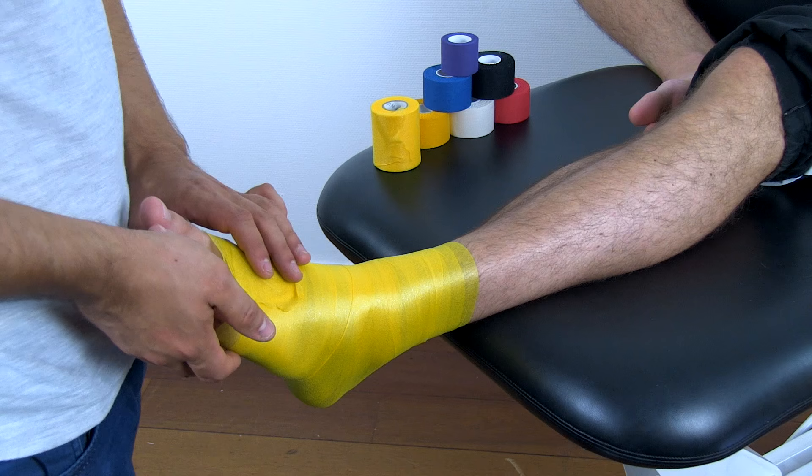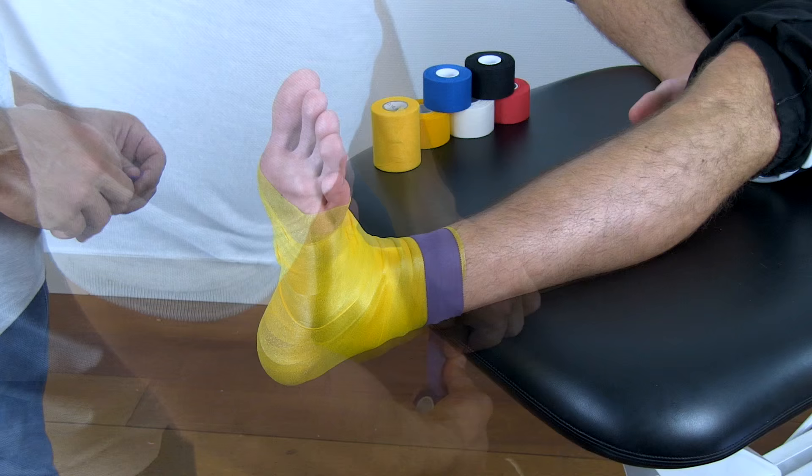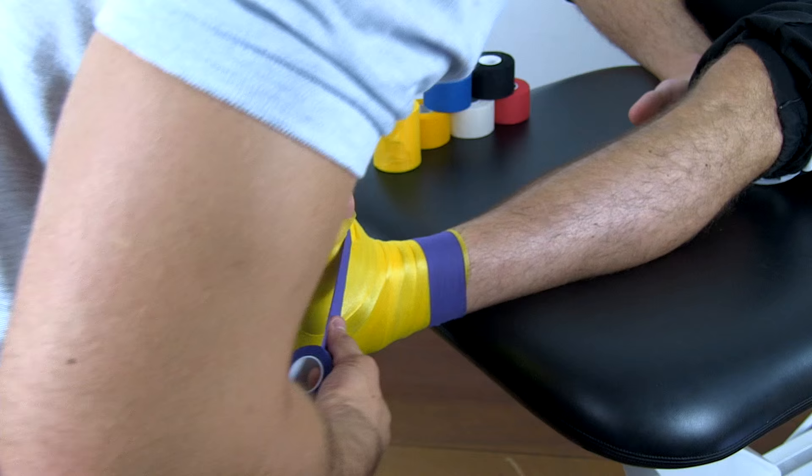Then, add two anchor points. The first one is going to be 10-15 cm above the malleoli and the next one proximal to the toes. Make sure not to tape entirely around the limb as this might impede blood flow.